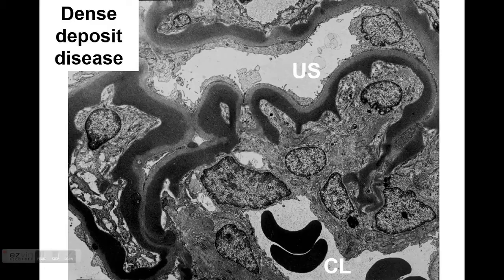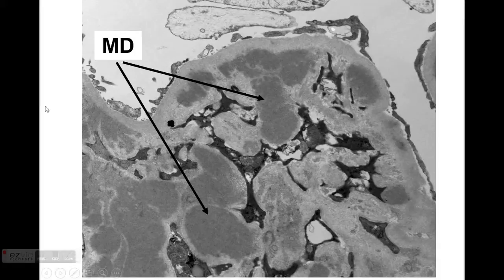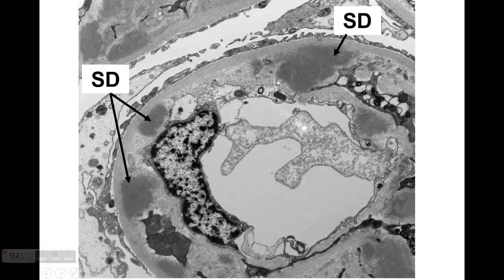would approximately look like. Sometimes you may have just mesangial deposits, and it would look like immune complexes almost, but again, immunofluorescence will be very important to study these and to put them apart. Sometimes you will see classic subendothelial deposits, like for example here, and then we would call this glomerulonephritis C3 or C3 glomerulopathy rather than dense deposit disease. So again, it's just a morphology that will put apart dense deposit disease from C3 glomerulonephritis or C3 glomerulopathy, and that's not really important as much as understanding what's the mechanism of this deposition.